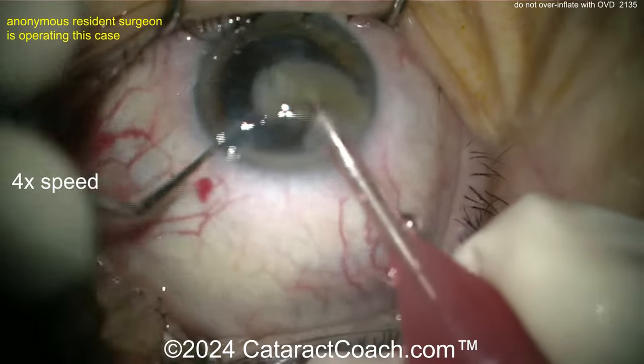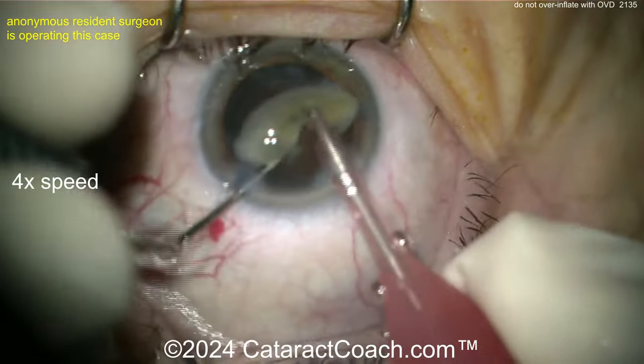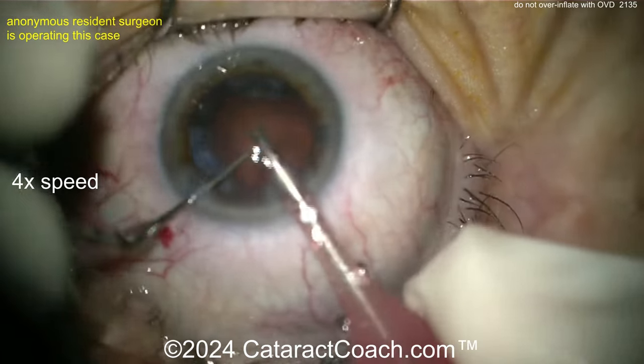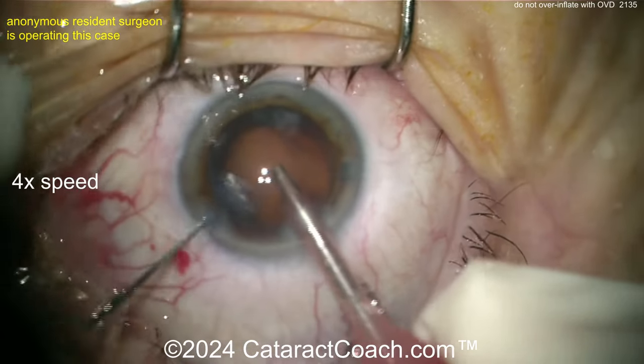Removing that nucleus. I also wish we had better draping here — look at those little inferior lashes scraping on the cornea. Not my favorite. But you see the nuclear pieces are coming out here; your cataract's almost done. And then being careful not to let that capsule come up.